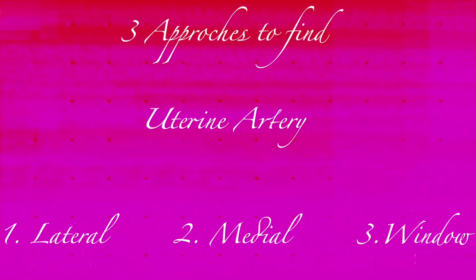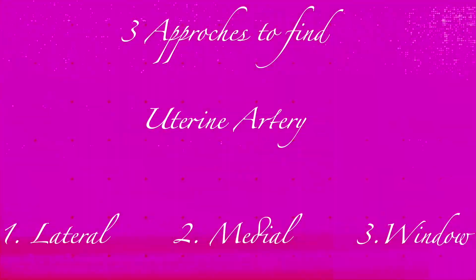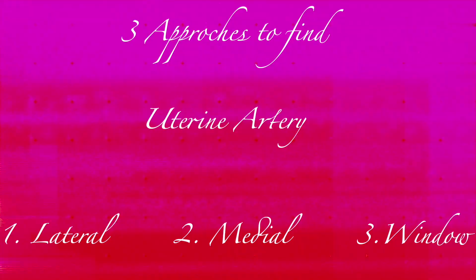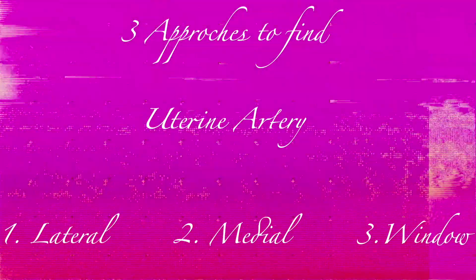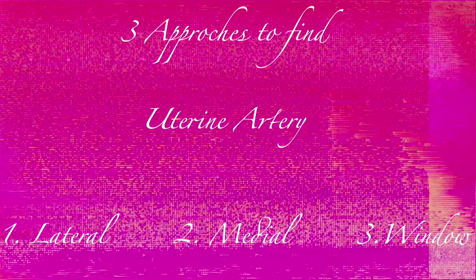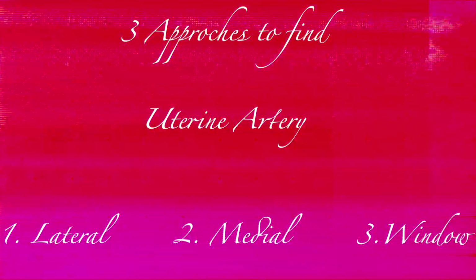Hi friends, so in this video we will only talk about approaches to find the uterine artery: lateral and medial to the IPL, and third, a window technique, details of which we will discuss in later videos.